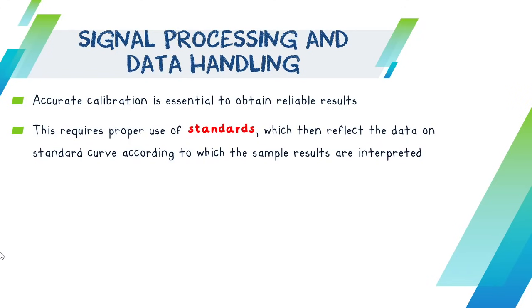In all sections of the laboratory, the start is quite hard, especially in your chem. You need to always run controls, although calibration is not done every day. If the controls do not come within range the first time you run them, then that is a problem. You must not proceed with processing samples unless your controls are okay. If you continue anyway, I tell you, all the results that come out will be wrong.